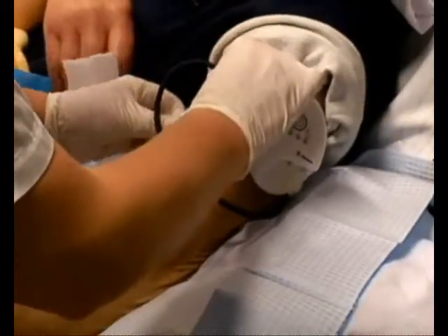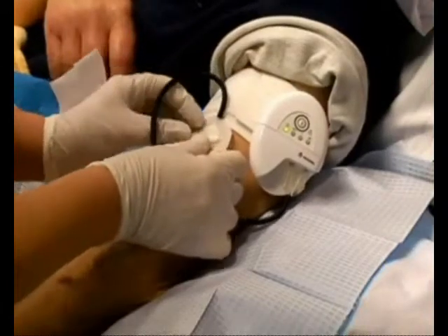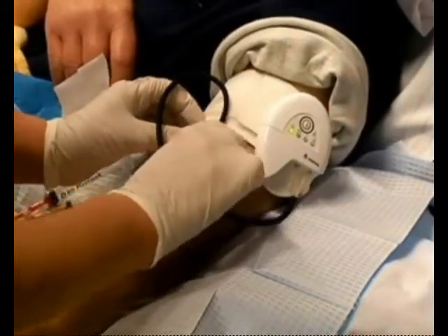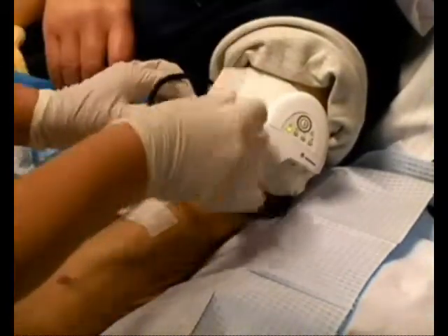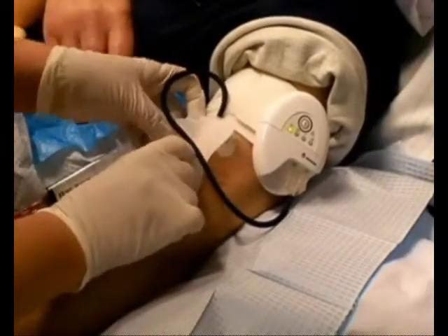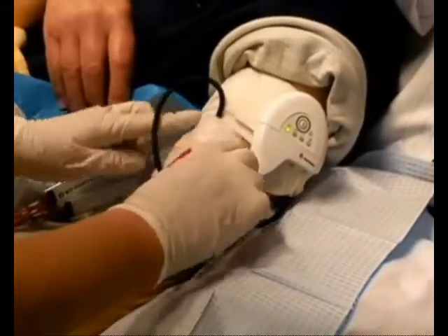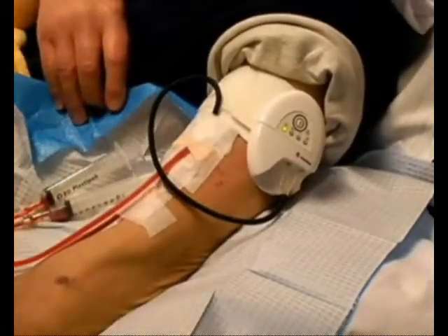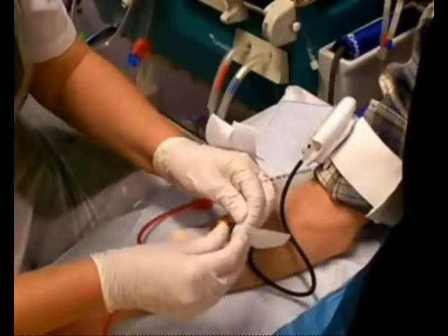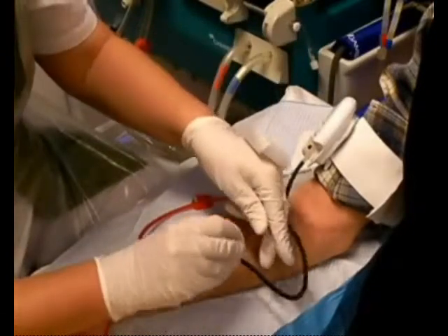Apply the sensor patch to the skin over the needle with the absorbent part of the patch centered over the puncture. Note that shown here is the shortest recommended distance between the alarm unit and the puncture site. It is also possible to fasten the alarm unit onto the lower arm and turn it to face in the opposite direction. Make certain that the sticky part of the patch doesn't cover the wings.